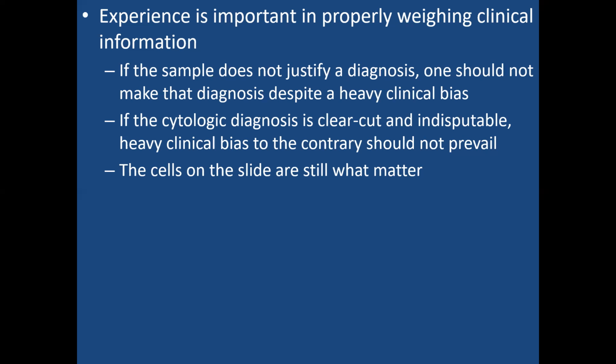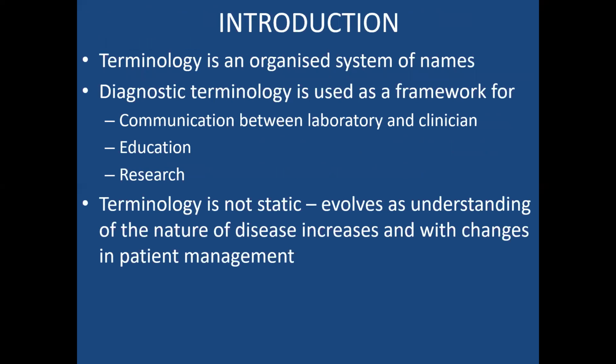And we don't throw away the slide. The slides are always there. If it can be reviewed, you can always bring the slide back and somebody else can look at it and confirm. So once you can make a clear-cut diagnosis, there's nothing really to worry about, even if the clinician's diagnosis is not the same as what you have seen. At the end of the day, the cells are there as evidence. So that's what matters.